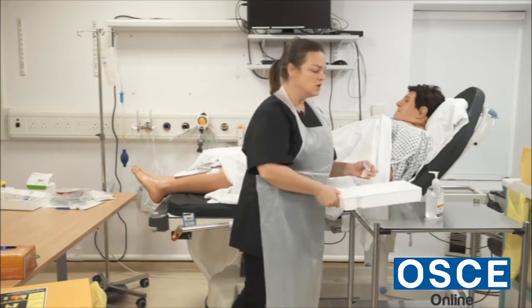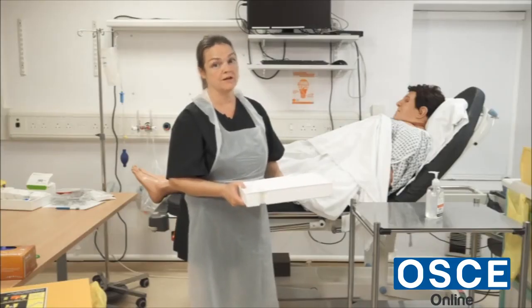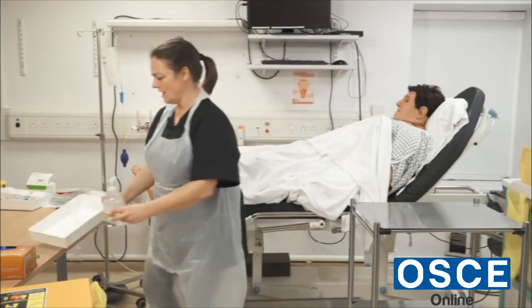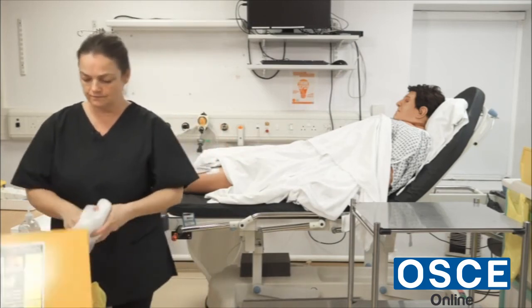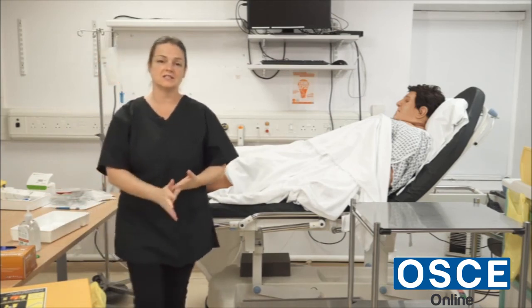Drinking plenty of water — two to three liters of fluids a day — is a good idea, and gentle exercise is also good. You should pass urine quite normally. I'll give you the buzzer and go and write this up in the nursing notes, then come back and check on you in an hour or so to make sure you've been drinking and have been able to pass urine. I would gel my hands, clean the tray, and document in the nursing notes that I've removed the catheter, the time, and that I've encouraged fluids. That is the end of the procedure.